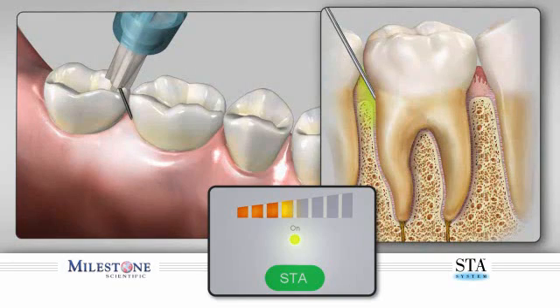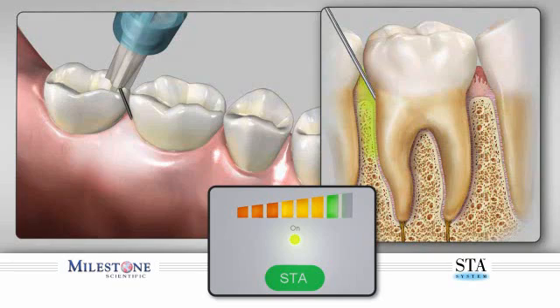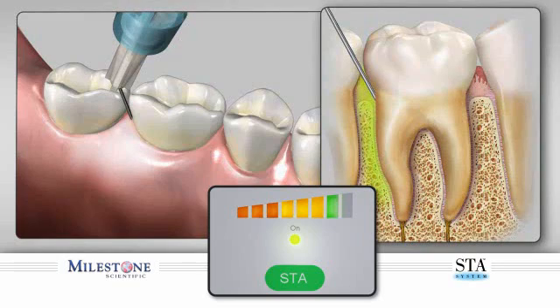Advance the needle forward slowly into the sulcus. Move the needle gently down until you reach resistance. Maintain approximately a 45 degree angle while holding the needle in place with moderate hand pressure. Do not use excessive hand force on the needle, as this may block the flow of solution into the tissues. Carefully control and stabilize needle movements using a finger rest.